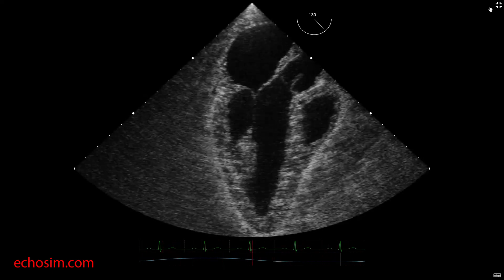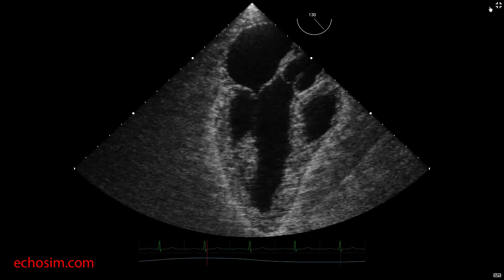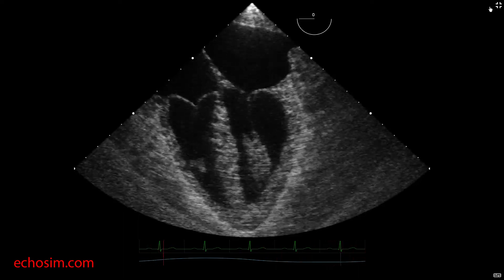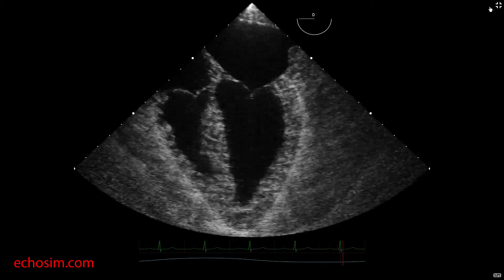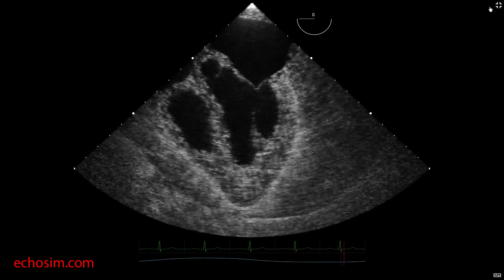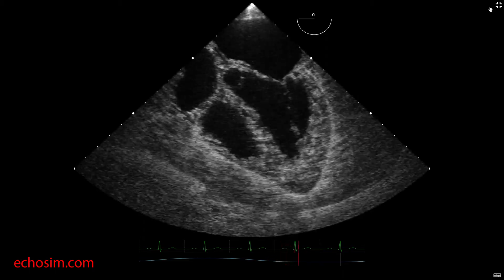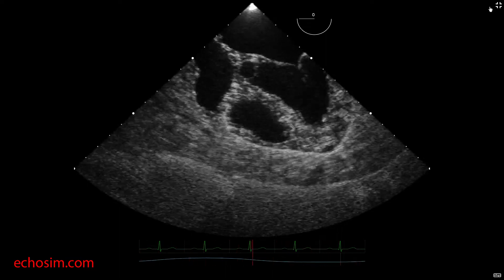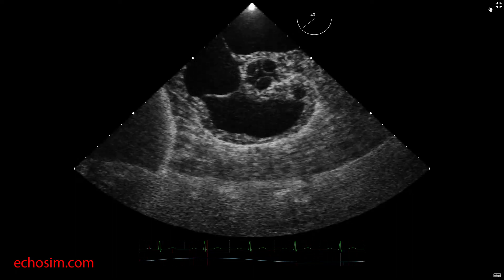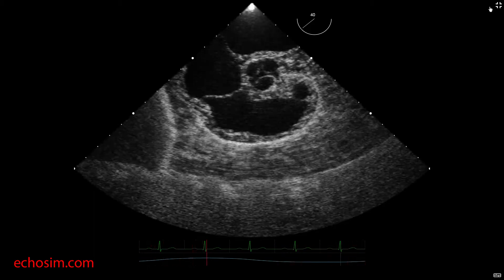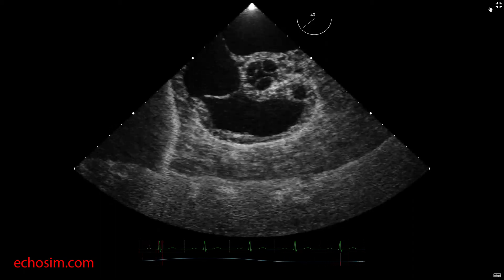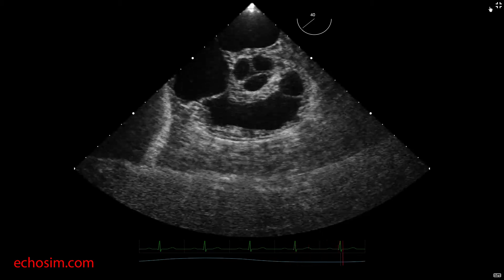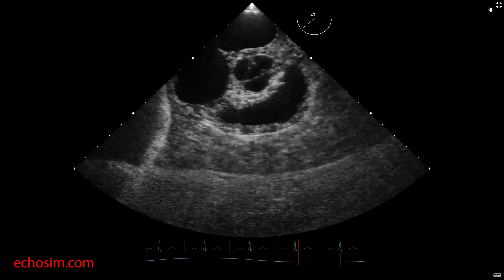The next view is the mid-esophageal aortic valve short-axis view. It is acquired by returning the omniplane to 0 degrees and releasing the big wheel to the neutral position. The probe is then withdrawn slightly to obtain the so-called 5-chamber view. The aortic valve and left ventricular outflow tract are placed exactly on center screen, and the omniplane is increased to approximately 40 degrees. The probe depth is then adjusted so that the three cusps of the aortic valve come into continuity. If the probe is out of plane, determine whether it is in the left ventricular outflow tract or the ascending aorta, and withdraw or insert accordingly. The endpoint is the view in which all aortic cusps are present and in full coaptation.